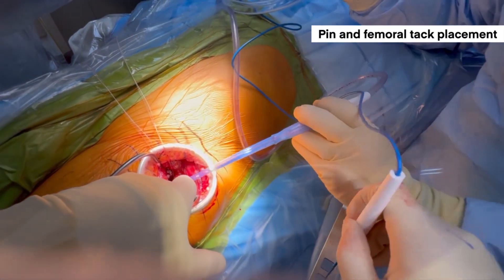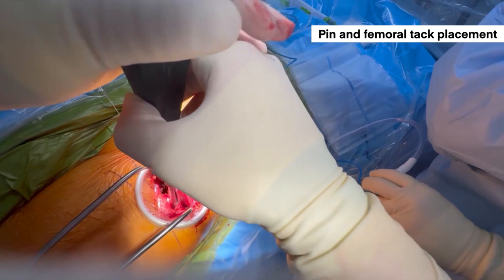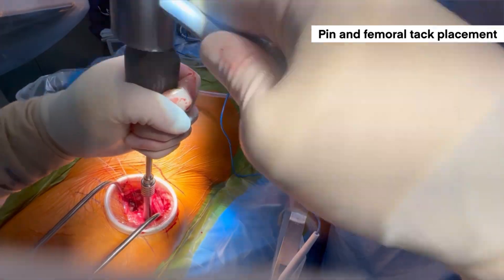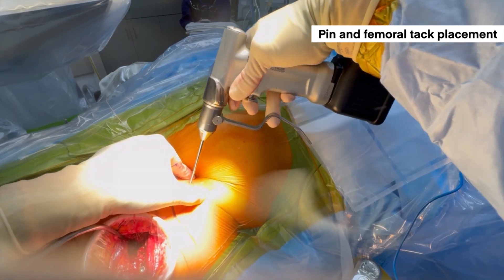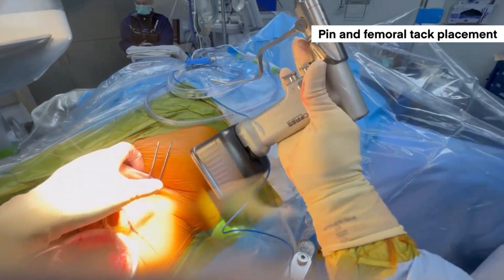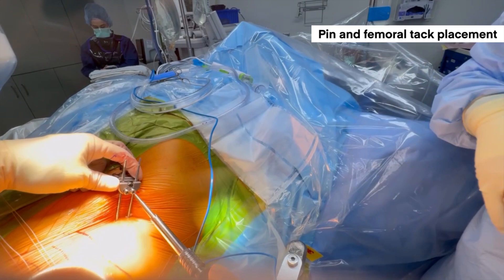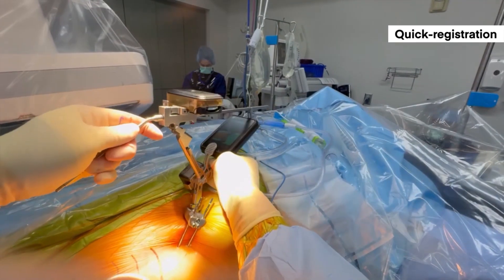I then proceed with my standard approach. Once I get to the point of the ipsilateral capsulotomy, I place the femoral tack just lateral to the vastus ridge in the greater trochanter. Then comes placement of the iliac crest pins, roughly two to three finger-breadths posterior to the ASIS, relatively in line and vertical as you can see here. You can use the pelvic base for guidance of those iliac crest pins, or you can freehand them. Once this is done, the pelvic base mount can be tightened with the screwdriver and secured.